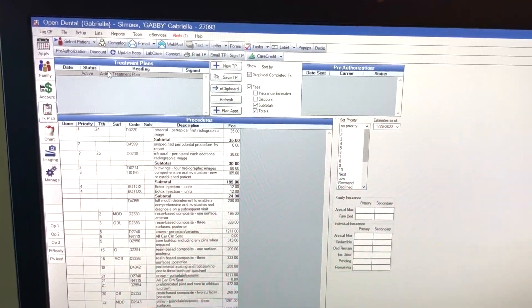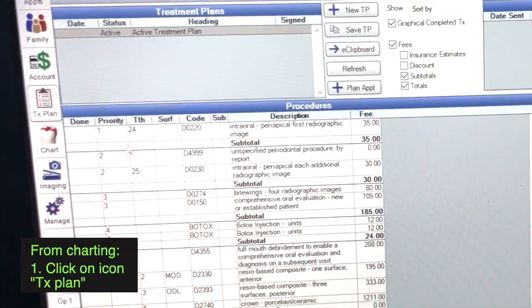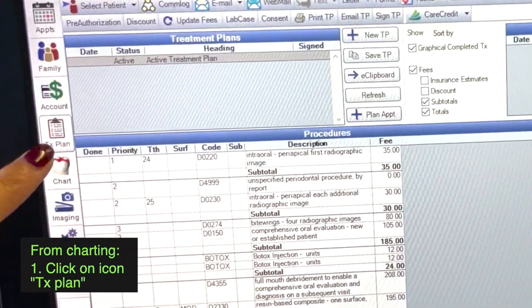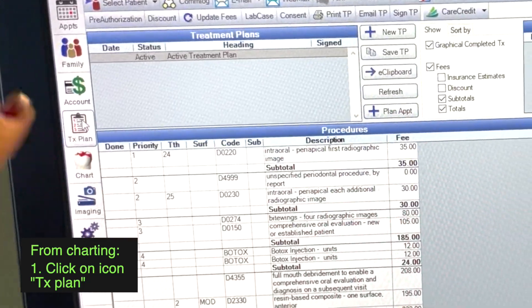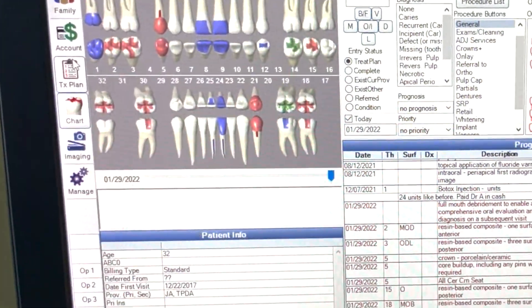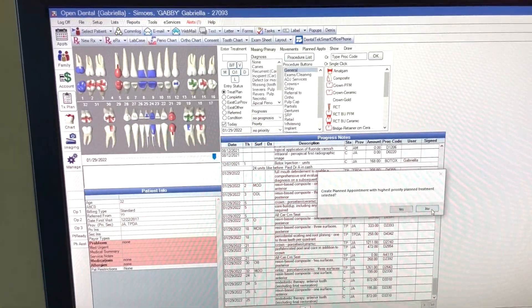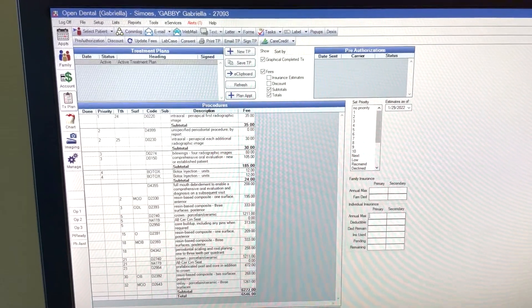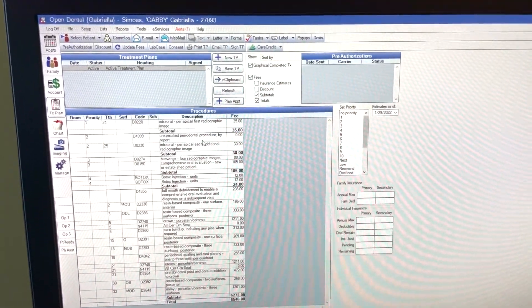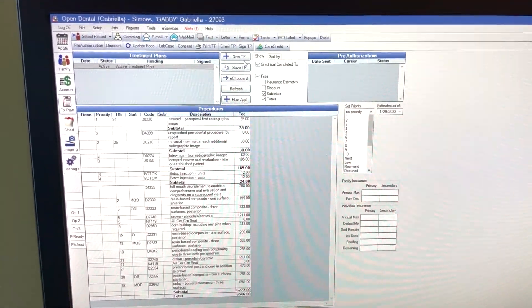Okay, so here our active treatment plans basically shows you everything. You click here first, right, treatment plan first. We went from charting to treatment plan. Active treatment plan, it's everything.